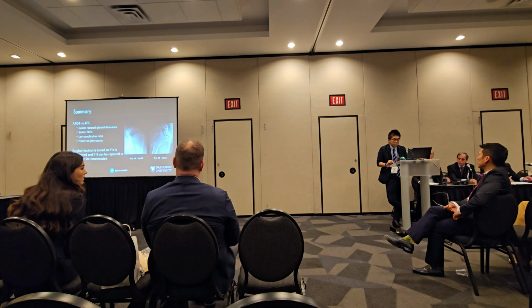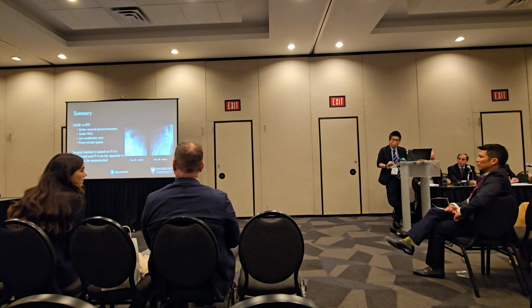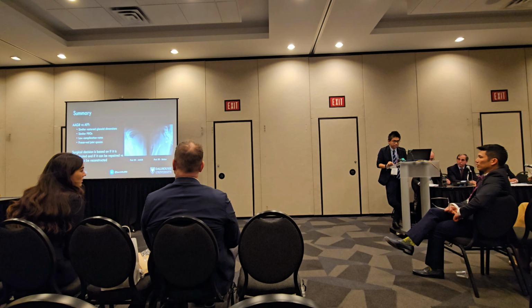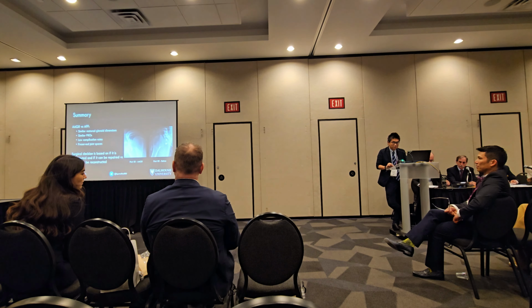If comminuted, arthroscopic anatomical glenoid reconstruction. If one big bone block, arthroscopic fracture fixation with EndoButton.